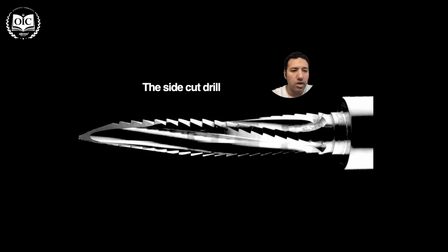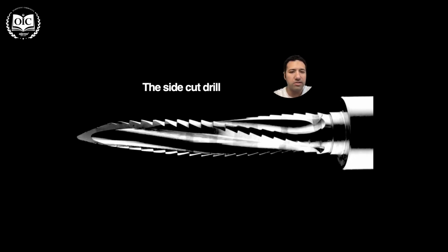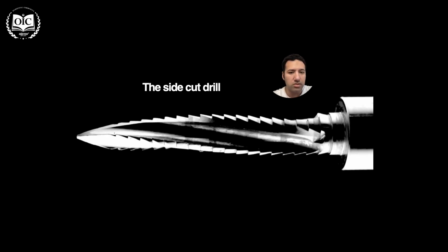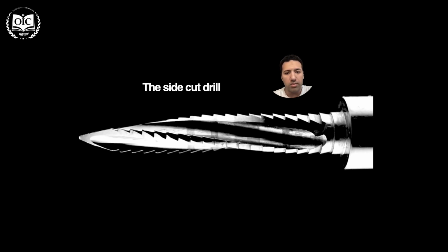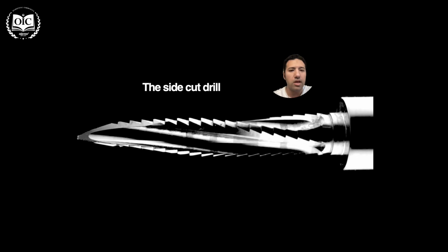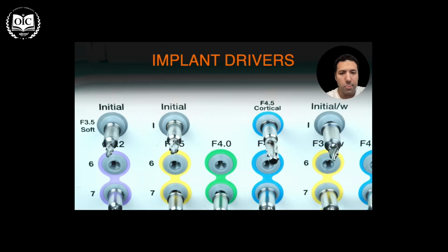So this is a close shot of my side cut drill. I've been using it for 3 years so far. It's still sharp and lusty, and I love how these products are manufactured. They're really efficient and really cost effective, exceeding even sometimes 50 to 100 osteotomies, and they stay as sharp as they started 2-3 years ago.